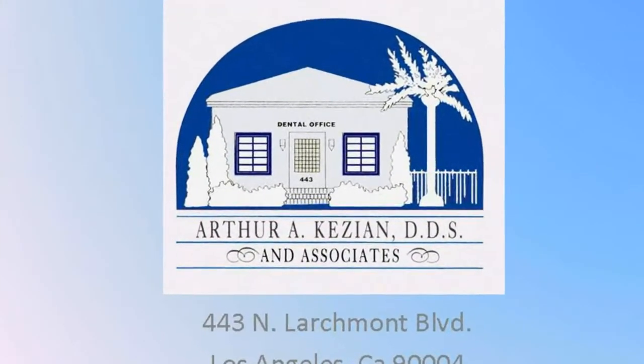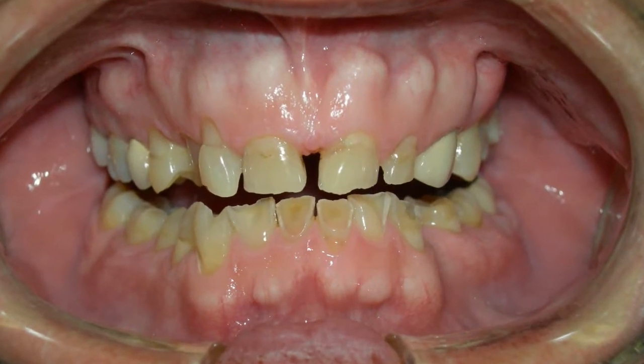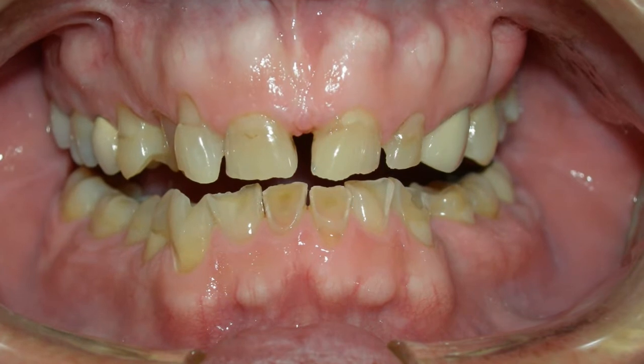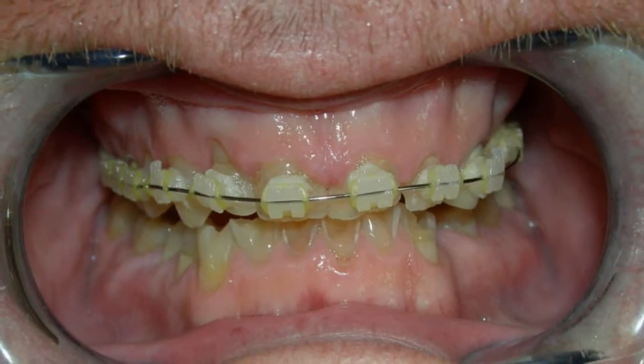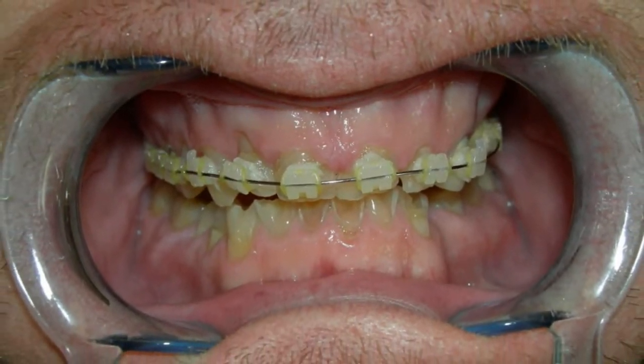Hello, this is a presentation for Dr. Arthur Kessian on lava crowns in Los Angeles. As you can see with this case, we had a patient who had very worn down teeth, which were very uneven. So we had him undergo some orthodontics in order to straighten out his teeth so that we could place on the lava crowns.